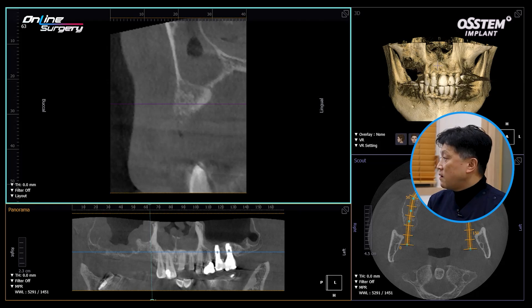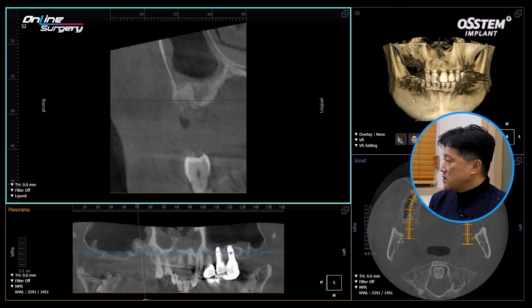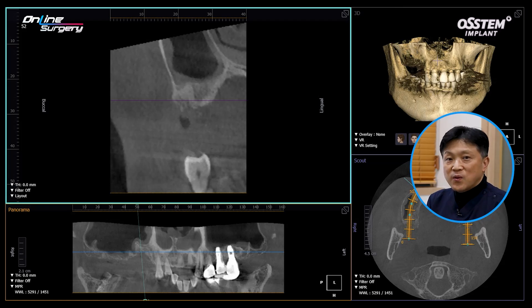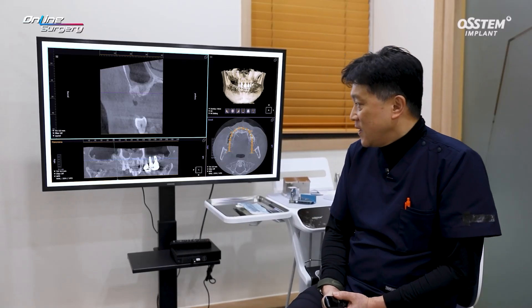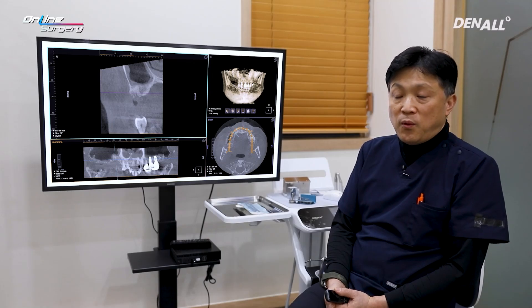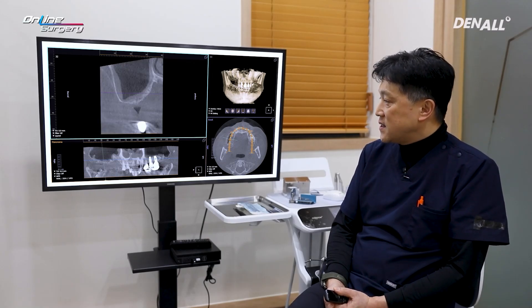Since then, surgery was performed after confirming a clean sinus. However, the bone graft materials did not turn into bone — they were mostly resorbed. It was devastating, but I could not give up, so I performed surgery once again.